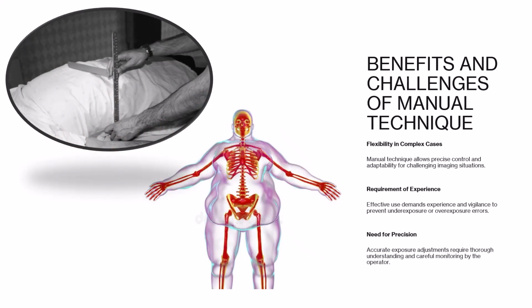Manual exposure offers flexibility in complex cases but requires experience and vigilance to avoid under or overexposure. It demands thorough understanding and precise adjustments by the radiographer.